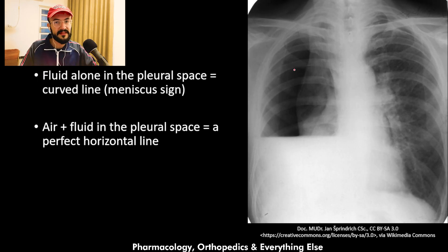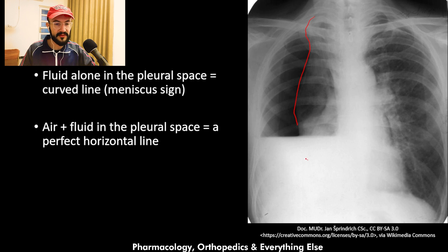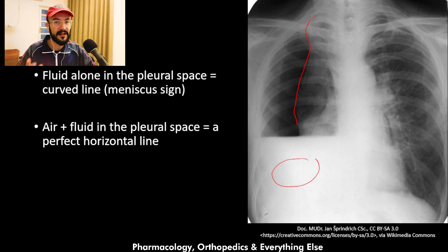This is another frontal chest x-ray. You can see the lung edge here, and lung markings are not seen beyond it, confirming a pneumothorax. You can also see that there is fluid in the chest as well, so we have both fluid and air at the same time.